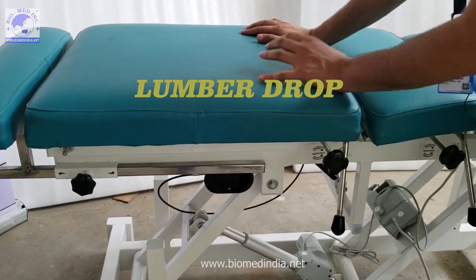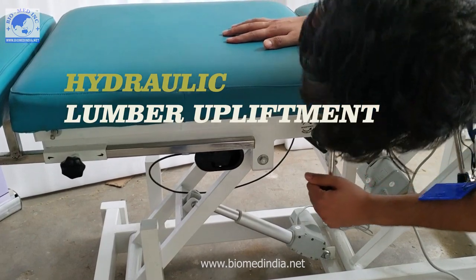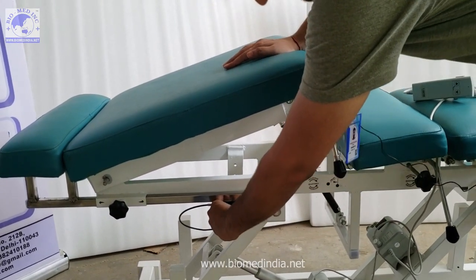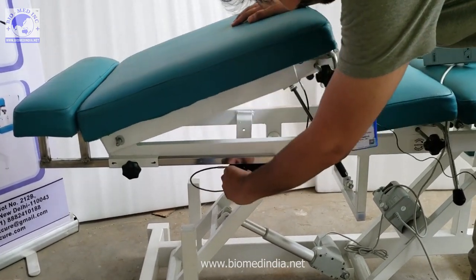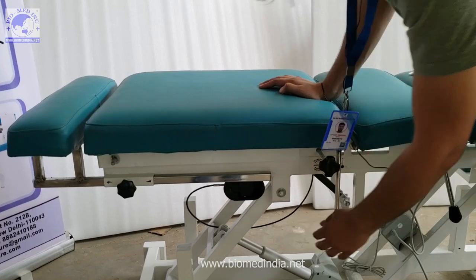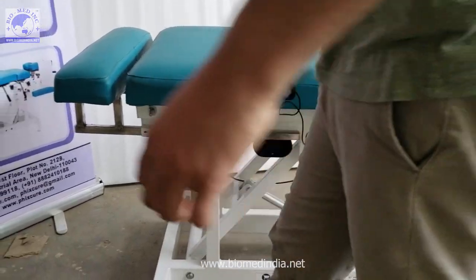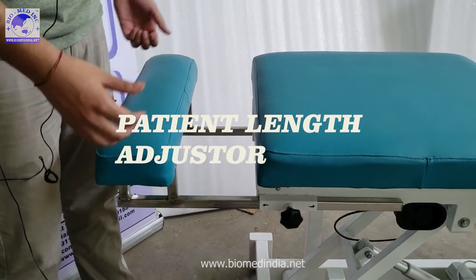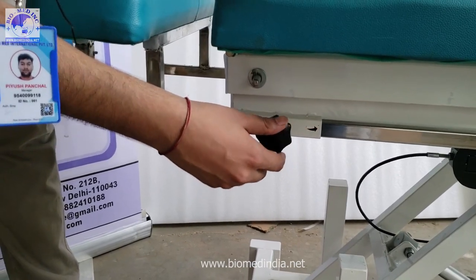The lower lumbar drop has two features: a drop function and, as in our Cox supportive mat table, a hydraulic tilt that can go up to 60 degrees. Depending on therapist guidance, you can set it at 45 degrees, 60 degrees, or neutral — whichever position is suitable. We also have a leg length adjuster; if the patient's legs are long, you can adjust it using the knob on both sides to fix or loosen it.